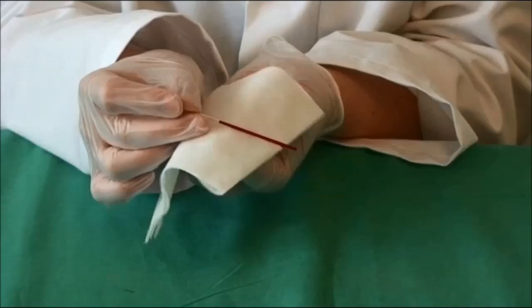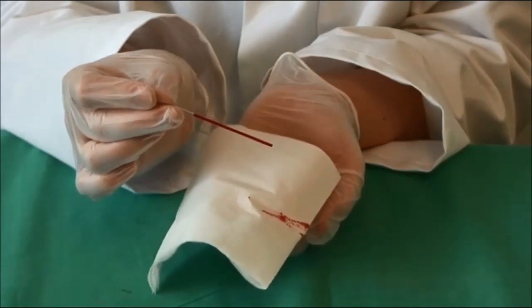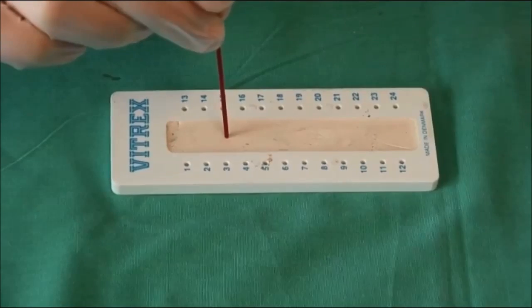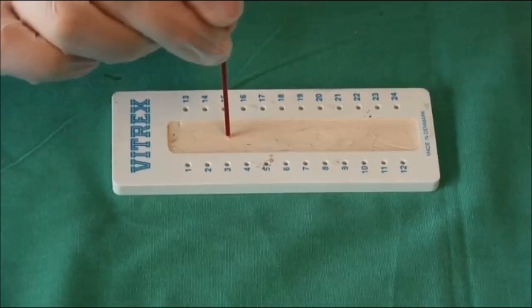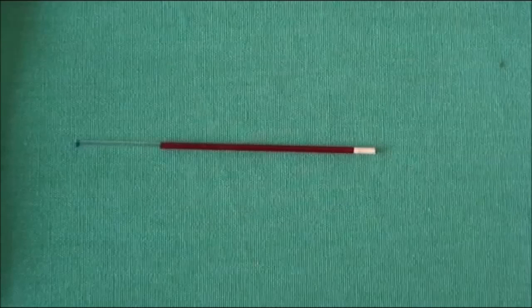Wipe the outside of the capillary tube with a clean tissue to remove any excess blood. Ensuring your finger is still over the end of the capillary tube, push the bottom of the capillary tube into a plasticine sealant at a 90 degree angle. This should form a plug at this end.